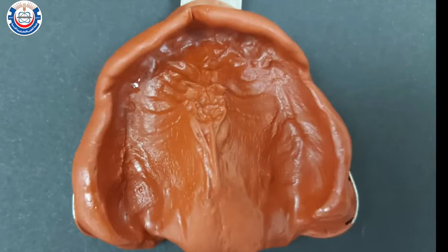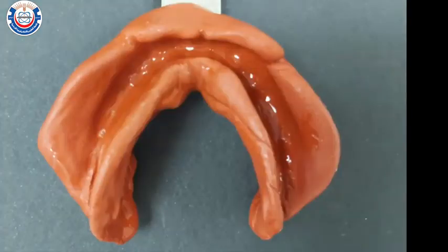Disinfect the impressions by immersing them in a glutaraldehyde solution, which you can find in special containers in the clinic. Leave them for 5 minutes, rinse them well with running tap water, and send them to the lab to be poured for the construction of the primary cast.